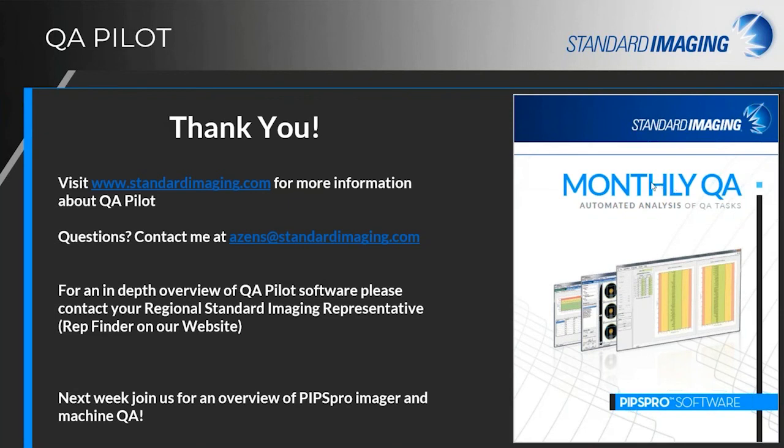Can you change the frequency of imaging? Of course. Any of those things. So like I said, there are presets that come with it, but you can create anything you want, whether it be an ad hoc basis, a bi-weekly basis, whatever frequency you want to create, you can do that. And like I showed you in there, you can say how many days until it's due. And then when it becomes overdue, it'll let you know on your summary page whether something's coming up or whether something's overdue.